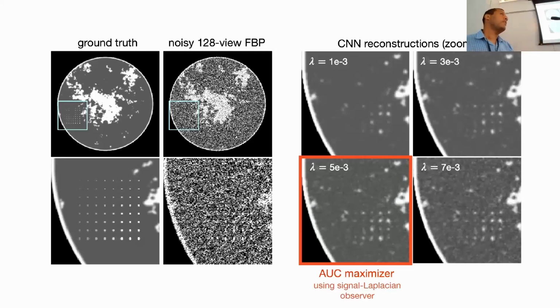That also brings up another interesting point: can you somehow penalize that? One of the things we want to look at is signal variability and background variability, because right now, for all the observers, the signal is known exactly and the background is known exactly. So we're hoping that will address that issue. Thank you.